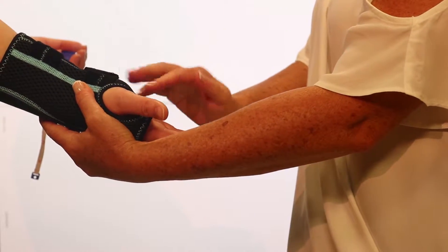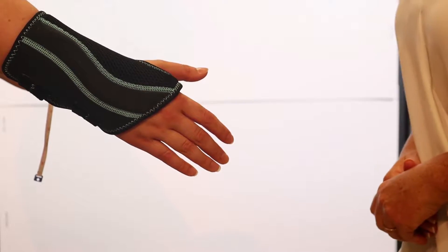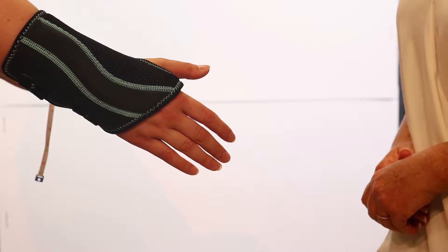Check the rigid stays to ensure they are centered in the palm and the top of the wrist. The brace should fit snug but comfortable, ensuring not to restrict circulation.